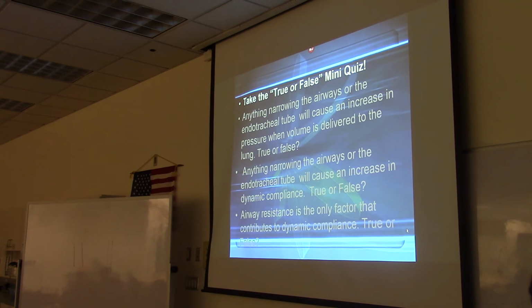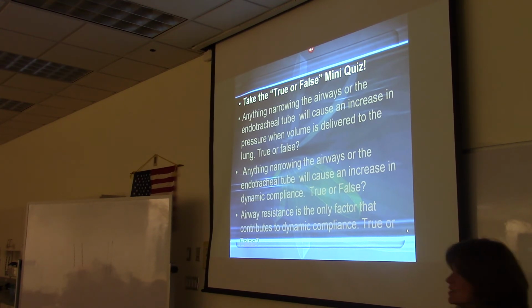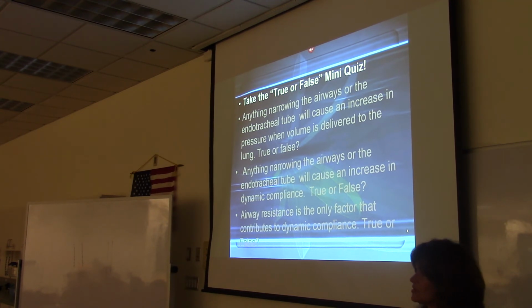What else contributes to the dynamic compliance? Pressure? Okay, so airway resistance is one. What about the alveoli, the stiffness of the alveoli? Yeah, that contributes to it also.